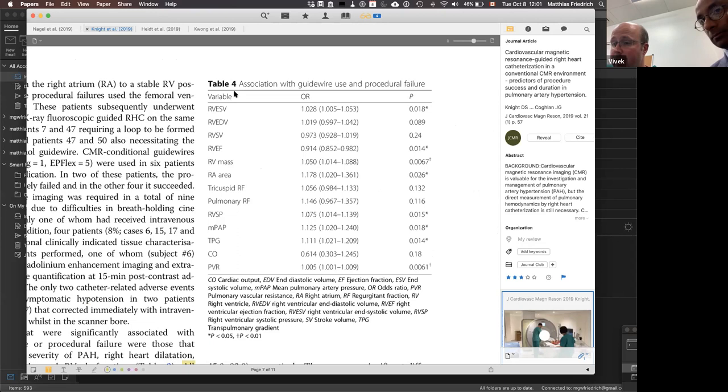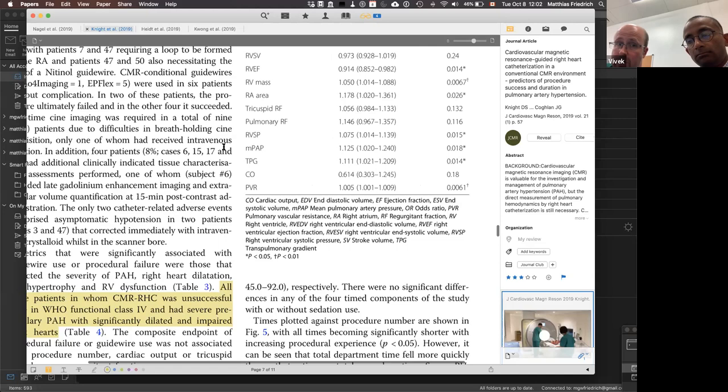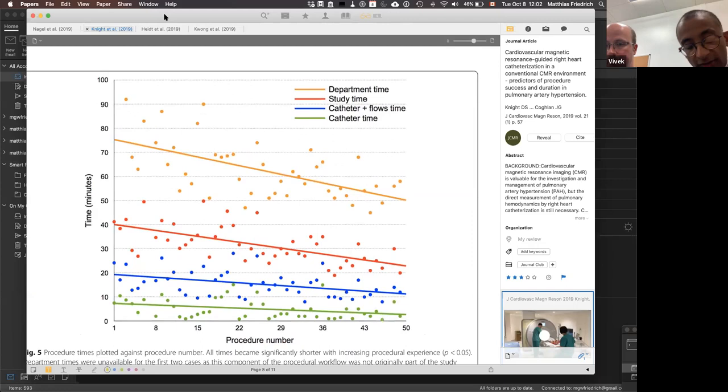But I think overall, those procedure times and that feasibility demonstrate that this is a clinical reality. And we're actually doing it; I'm about to do our last case this afternoon. To finish off and conclude, what we've shown is that you can do it in a normal clinical MR scanner, and you don't need a lot of fancy equipment. As I said, we've done about 100 cases now. We're looking at about a 5% failure rate, and it's usually in the very, very sick patients.